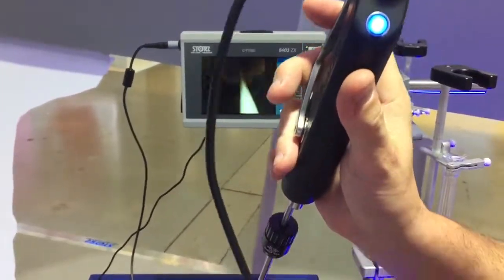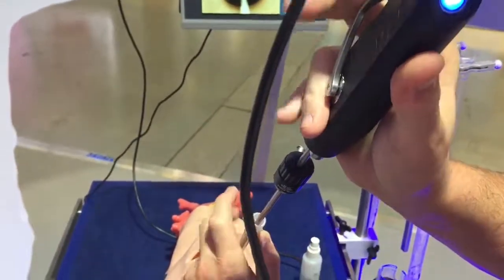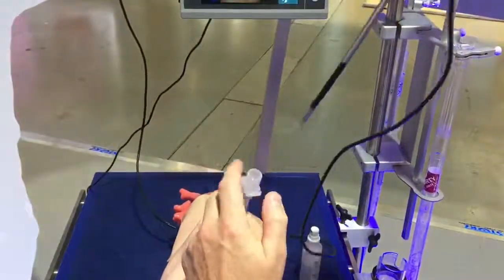Again, I can railroad the tube. I can even confirm the depth of the tube placement by lining up my mark with the vocal cords that I can usually see through the tube. So, now I've facilitated the intubation again.